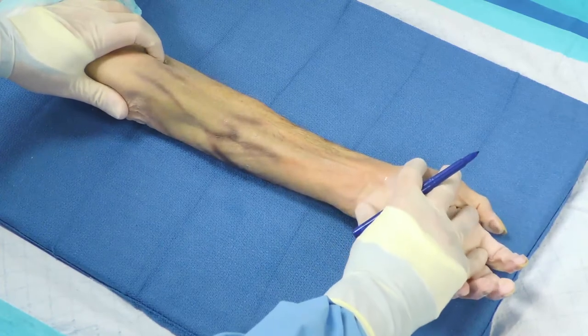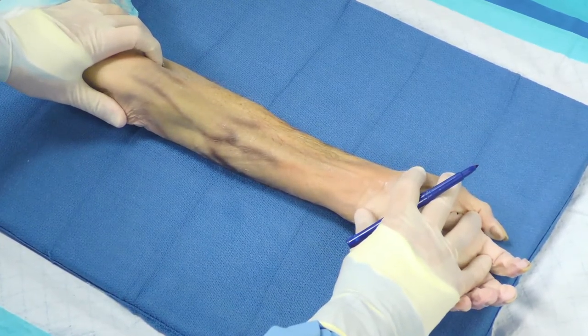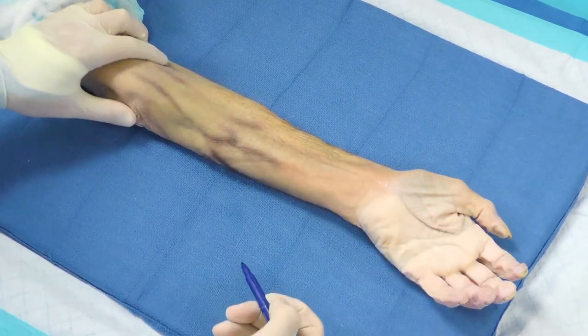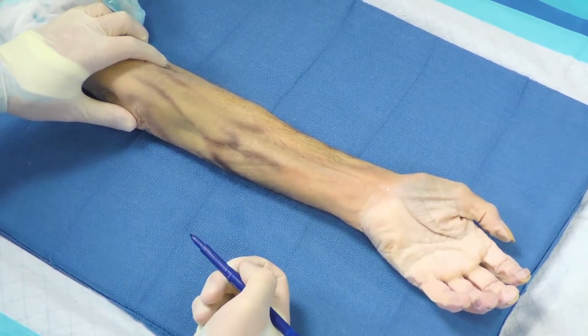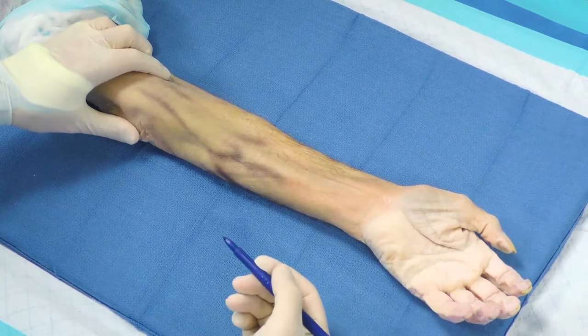Today we're going to talk about surgical approaches and fixation options for both bone forearm fractures. We're first going to discuss the volar approach to the radial shaft, and later we will talk about the dorsal approach to the radial shaft.